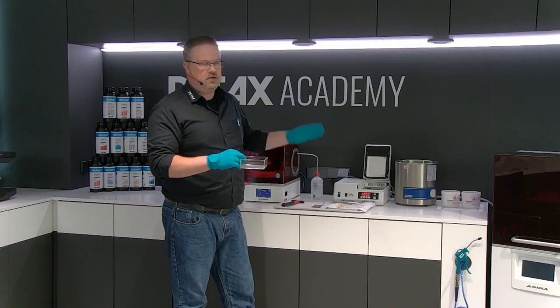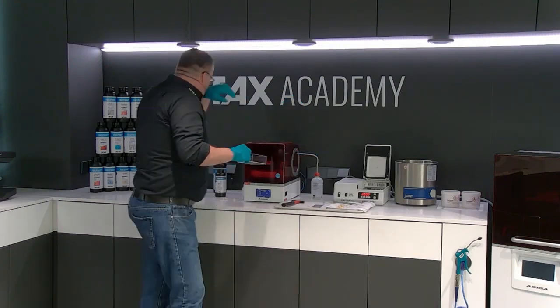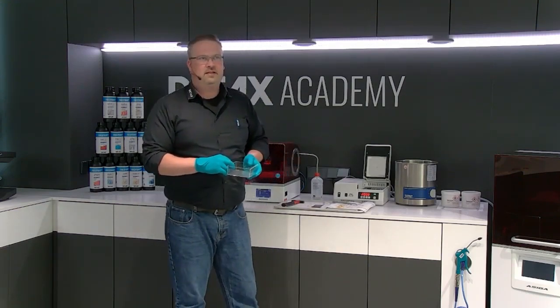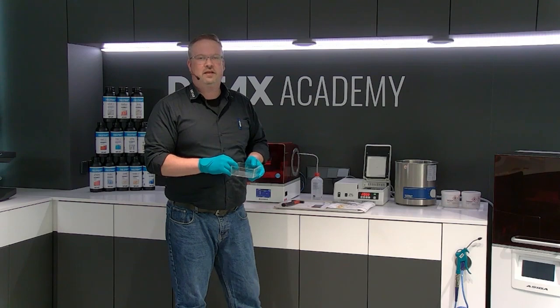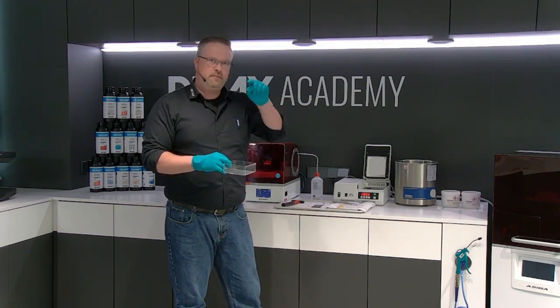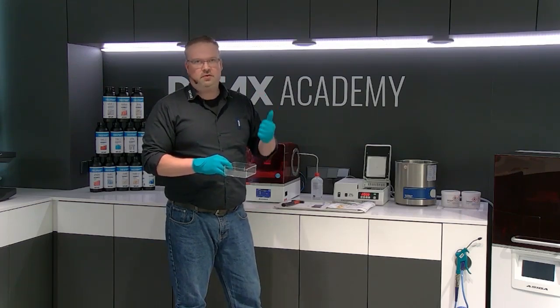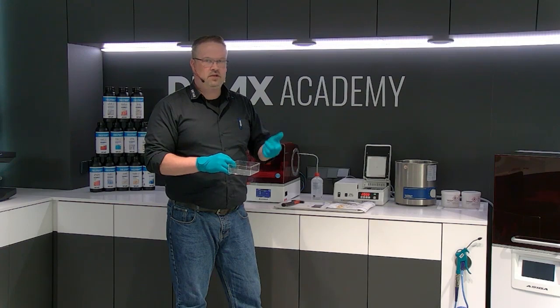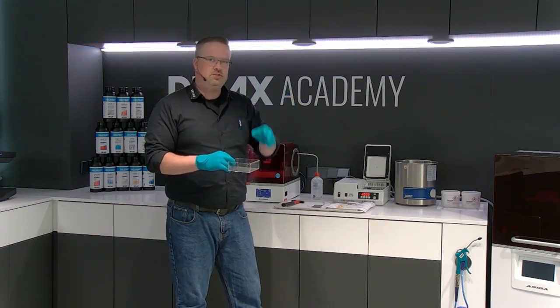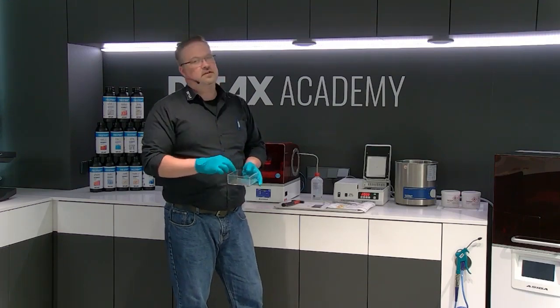You can also use some other curing devices. You can find all the information about the validated systems on our website. Please search for the brochure. In our 3D brochure, you can see all the printers you can use, all the curing devices you can use. At the end of the brochure there's a validation sheet. Take it inside here. Oh, there's one thing.